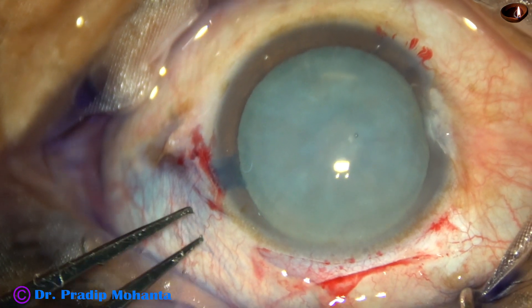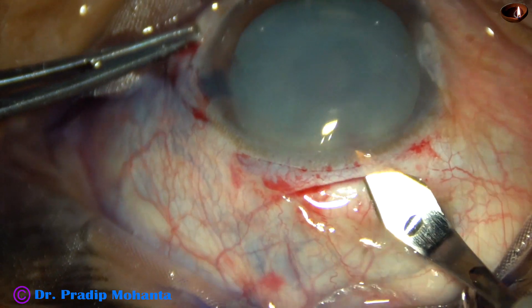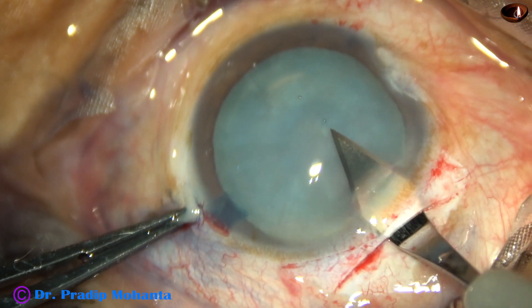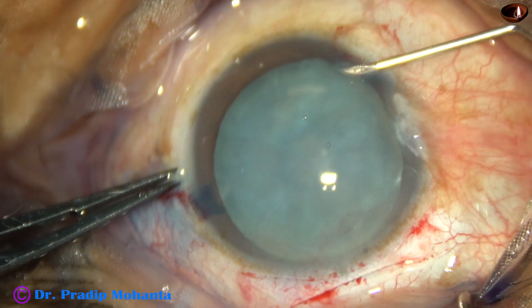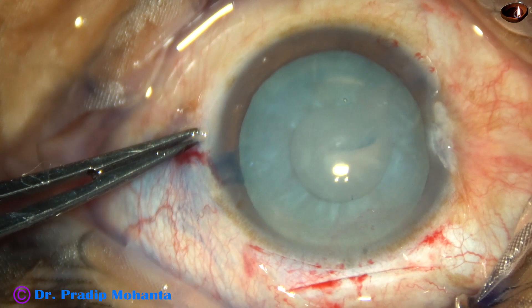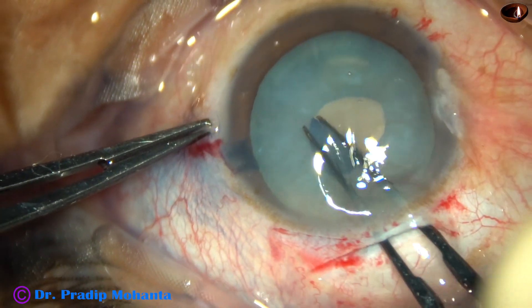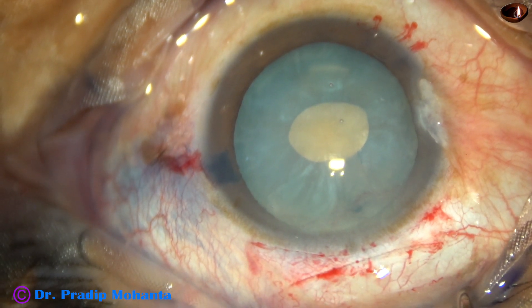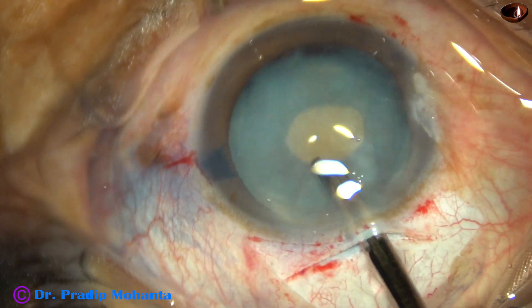And now, capsulorhexis. In intumescent cataract, it is always good to use Utrata forceps. I am opening the sclerocorneal tunnel — this is a 2.8 mm opening. I am incising the capsule and making a C-flap, not a radial flap, a C-flap. I am using the 2.8 mm opening to do these small rhexes — you can call it mini-rhexis, or by my name, Mohanta's Mini-Rhexis — Momirex.